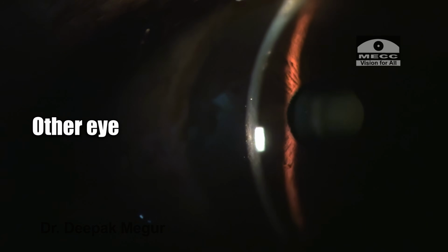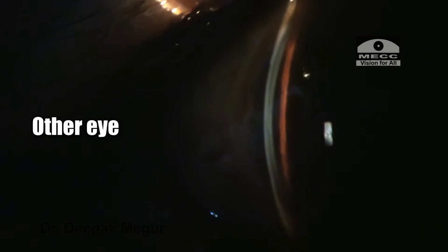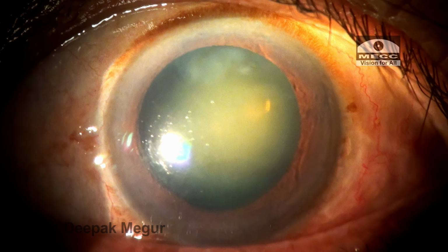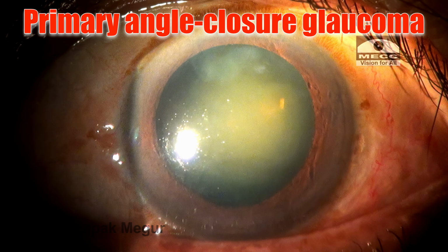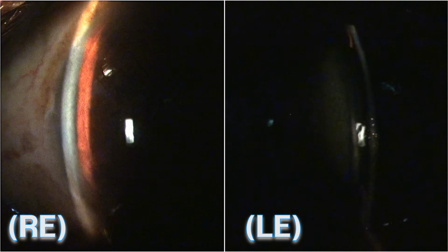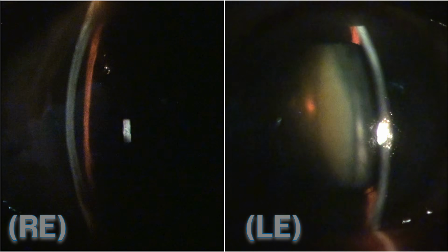So curiously, I had a look at the other eye. The other eye was alright. The chamber was not as shallow. And with this picture in mind, I thought this is probably a primary angle closure disease because the disc was still normal. So the disc appeared normal and the angles were closed in this eye. But surprisingly, in the other eye, the angles were not as narrow. I could still see the pigmented trabecular meshwork in more than 180 degrees in the other eye. On the contrary, the affected eye had a 360 degrees angle closure.